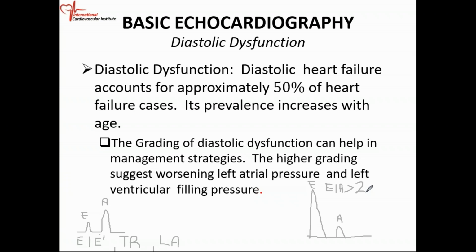So the ejection fraction may be 20%. You do your E to A ratio and it's greater than 2. If you do your E prime, remember E/E prime greater than 15 suggests elevated left atrial filling pressures. And in these patients, your E/E prime ratio is greater than 15.